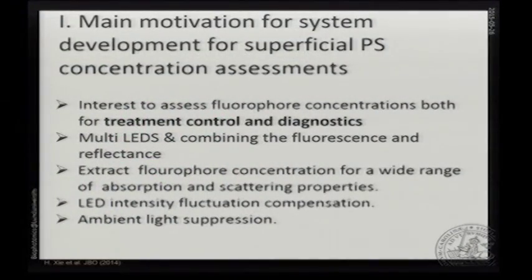So it's not only the fluorescence that we have, but we also have to cope with the attenuation of the light inside tissue. And then we do it with LEDs and single-point photodetectors. I'm coming back a little bit to why we try to not use a spectrometer.